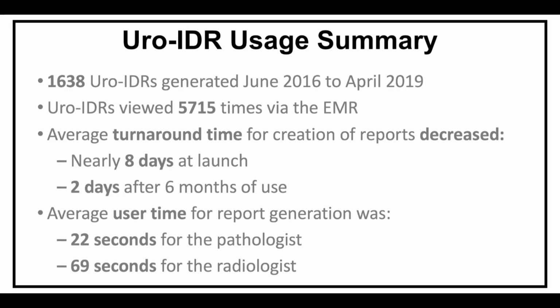At our institution, 1,638 individual URO-IDRs have been generated between June 2016 and April 2019. There were 5,715 views of these documents via the EMR.